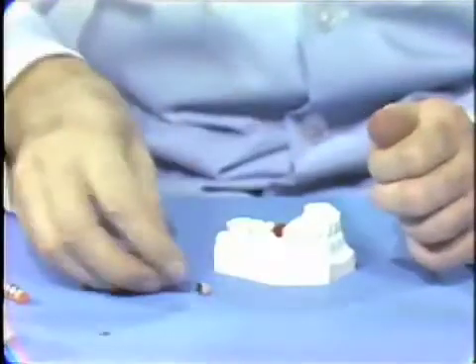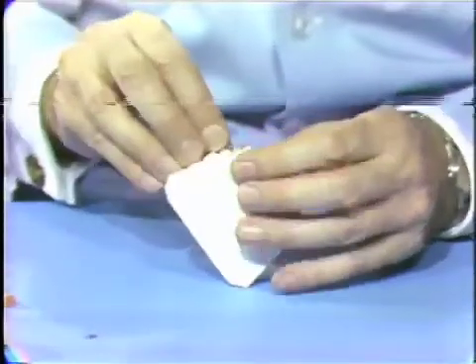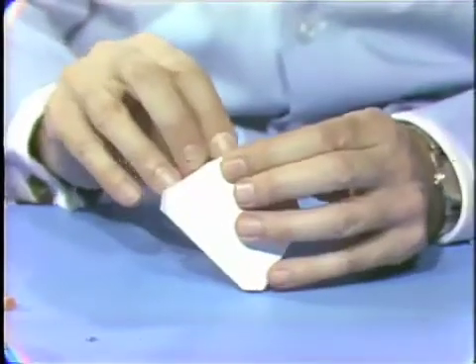The next step is to orient the facing in position prior to waxing up the occlusal surface.